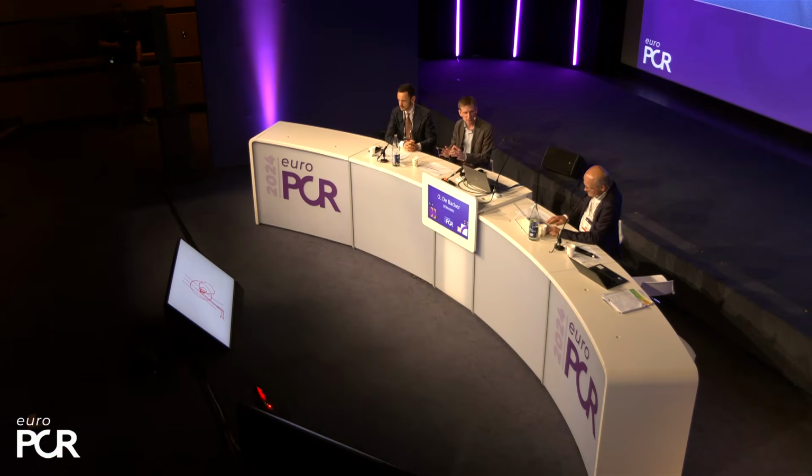So I still personally like this small angio. It doesn't cost anything, no effort at all. You have the wire anyway, you have your 6 French sheath, you don't have to unpack anything, you introduce it again, and you make a small angio with 5 cc contrast. It gives me that extra security, but I know there are some very experienced, high volume centers who don't do it and do the pure echo control at the end, and that's sufficient. I think with increasing experience, it's acceptable to do that.